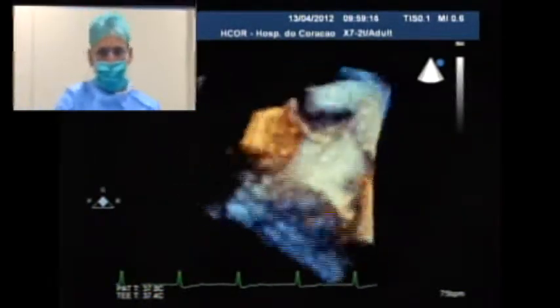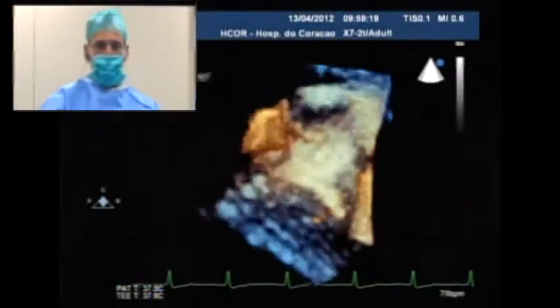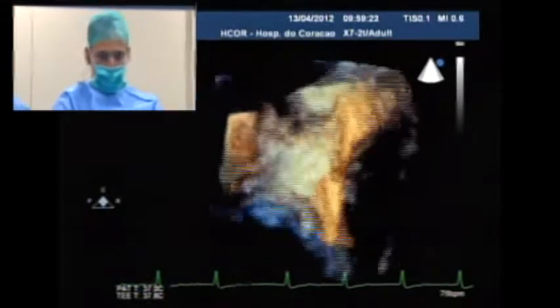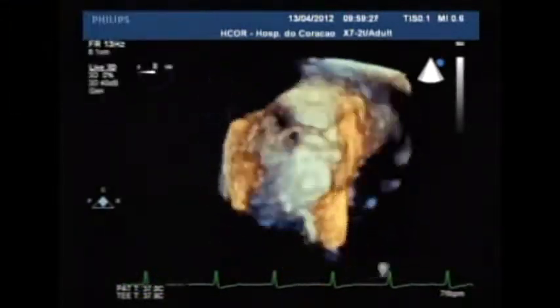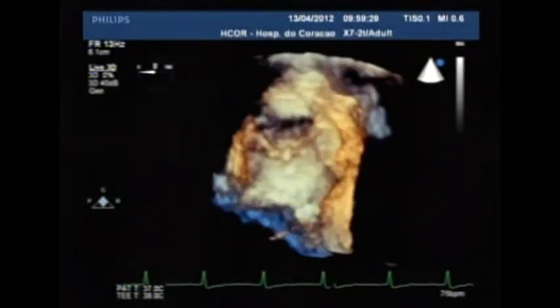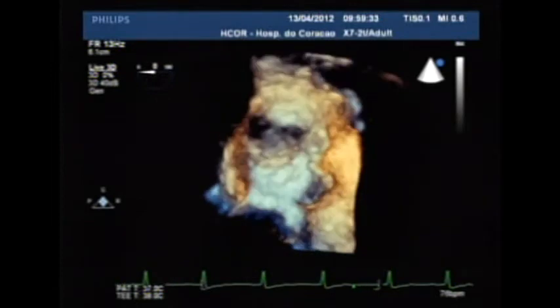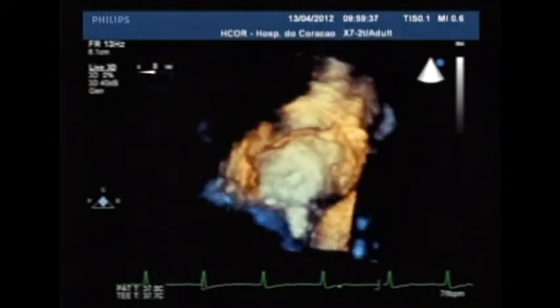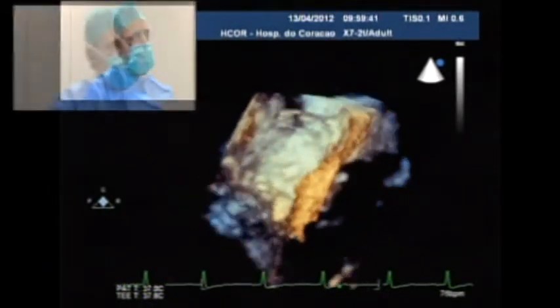Alex, any comments? Pedro, one question. Carlos, I'm sorry. Carlos, one question. If you have a perimembranous VSD, talking about the rim to catch the device, you need some tissue to hold the device. Is there any limitation on the perimembranous VSDs in that regard? Yeah, that's a very good question, Eberhard.